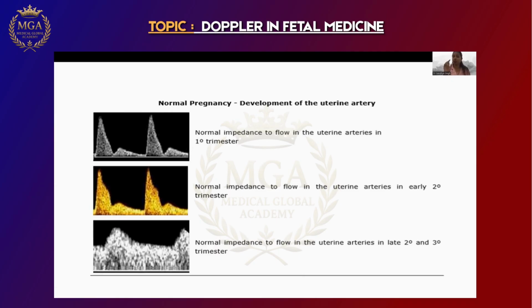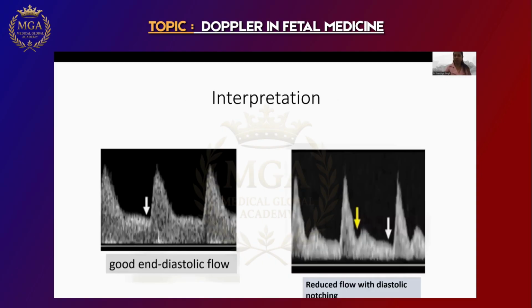So based on this funda, the cutoffs are high in first trimester because we know naturally also the cutoff will be high only because the flow is less in first trimester. As the baby grows, trophoblast invasion happens, villi expand, pressure goes down, flow increases. This funda I hope everybody is clear with.